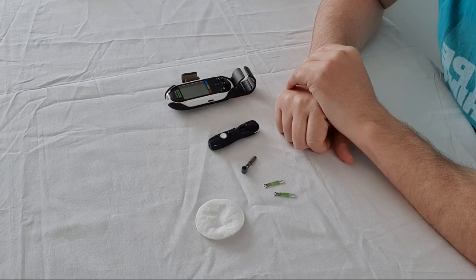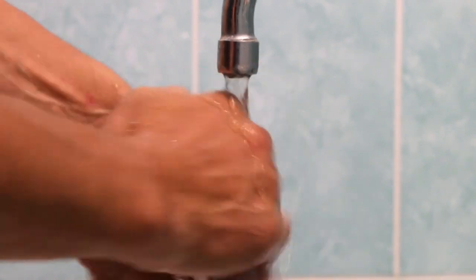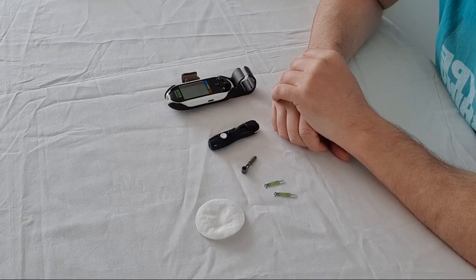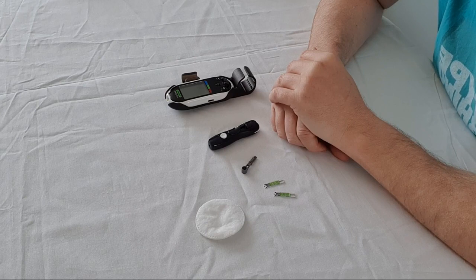My first suggestion is to always wash your hands with soap or an antiseptic wipe, because we want to get rid of any excess germs that might be on your fingers before we prick them to take the blood test. It also warms up the fingers, and it's a lot less painful when you've got warm fingers, so please use warm water.